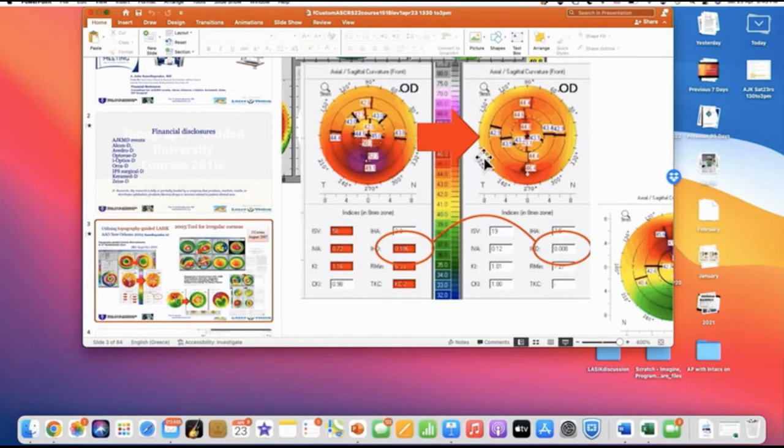Because there's no question that this cornea gives better quality. This patient, when they turn 68 and they have cataract surgery, will do far better. It'll be far easier to calculate an IOL for this patient than this patient, same patient with different cornea. But it's very hard to explain to a 19-year-old and their 45-year-old parents who paid 3,000 euro for the procedure, that this is better at 3 diopters of myopia and uncorrected 20/60 than this with planar refraction and 20/20 uncorrected.